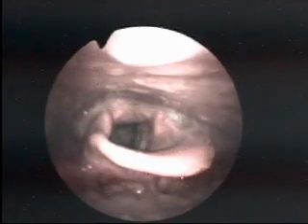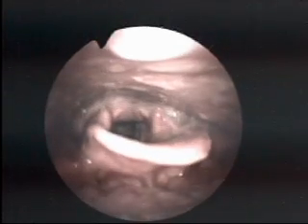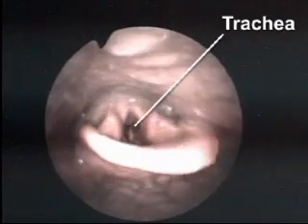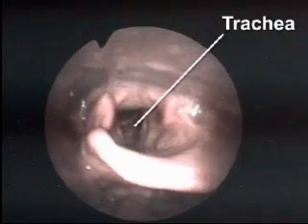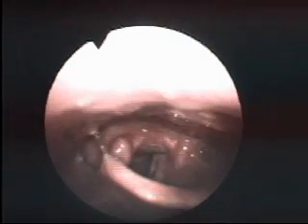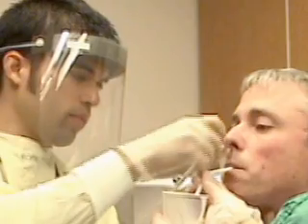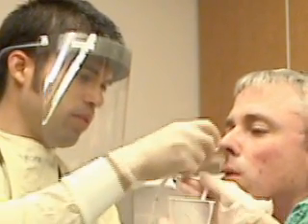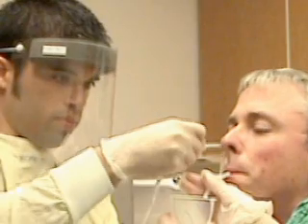Note that in this endoscopic view of the larynx, the trachea is frequently open and may be accidentally intubated with an NG tube. Note also that as the patient swallows, the laryngeal apparatus arises and the epiglottis covers the glottis, preventing tracheal entry. Once past the larynx, the tube may be inserted rapidly to the predetermined depth.